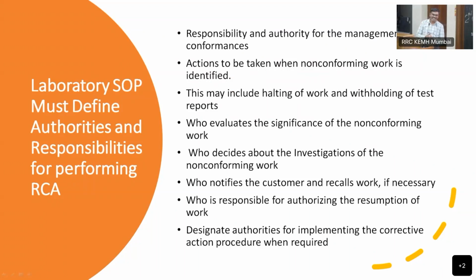Should not be like that. Right? So, yeah, you have to critically see how many QC outliers are there. How many times your first QC is out. Correct? And what is the timing between these two QC taking out and probably reconstituting or something?